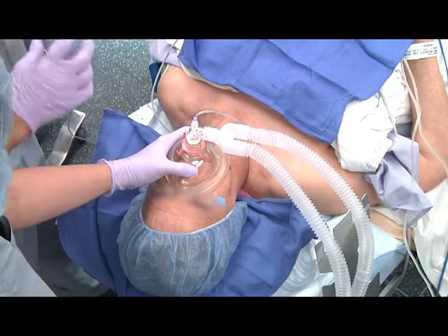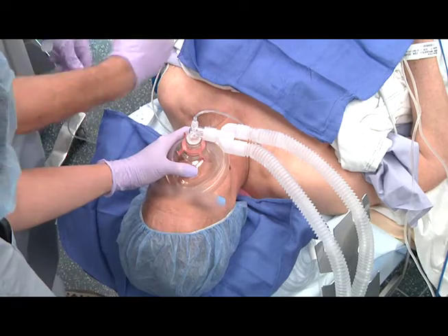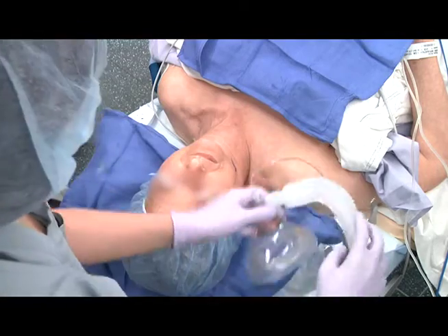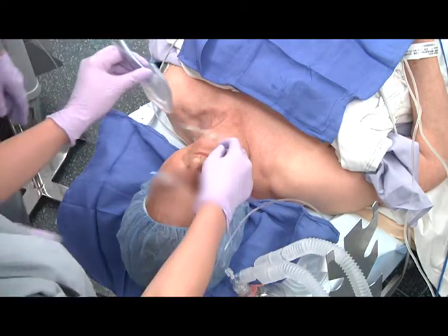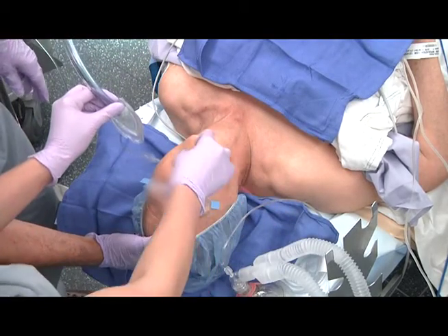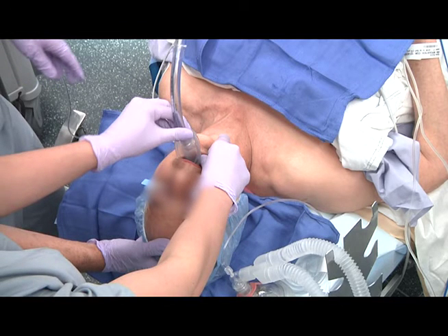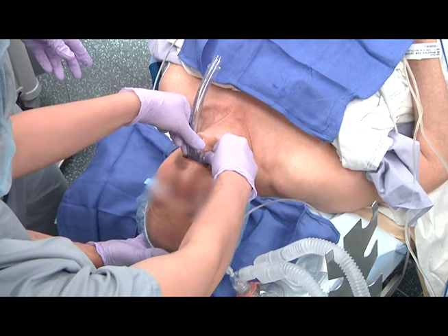This video starts with a good example of the classic technique for placing a unique LMA. All the air has been removed from the LMA cuff and it has been lubricated on its palatal surface. The head is extended and the operator uses a thumb and first finger technique for opening the mouth. The LMA device is taken in the opposite hand with the first finger placed between the barrel and the cuff of the LMA. The tip of the LMA is placed into the patient's mouth and immediately against the hard palate. The vector force of the operator's hand using that first finger between the barrel and the cuff is directed towards the palate.